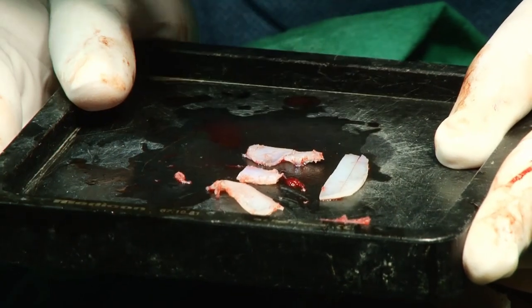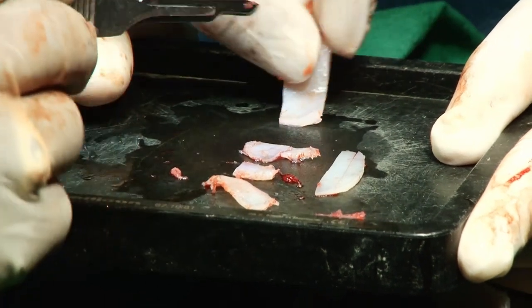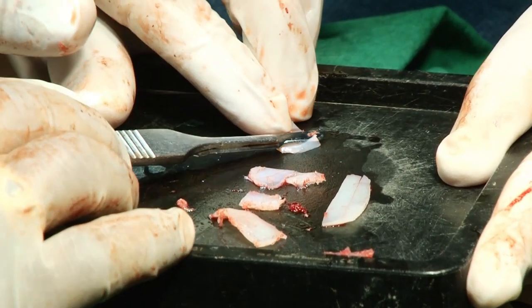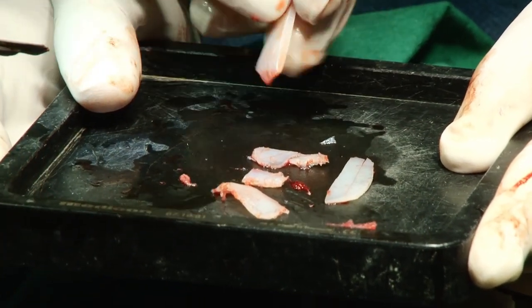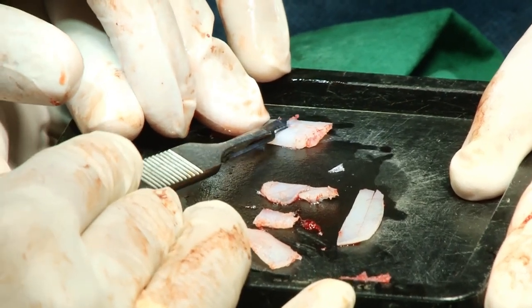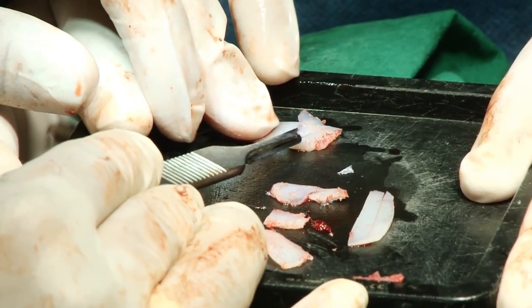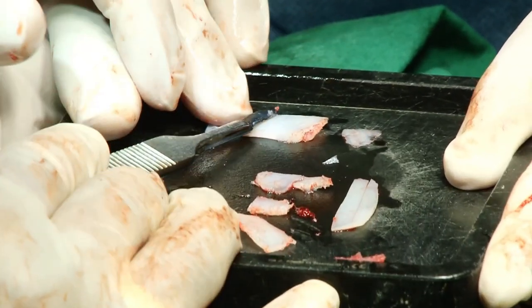Sir, this is the usual approach when you have an anterior fracture, as in this case. You leave the fractured part on site and reinforce it afterwards with a piece of septum on the other side, I suppose? No, Oliver, this is my usual approach. This is my usual approach.